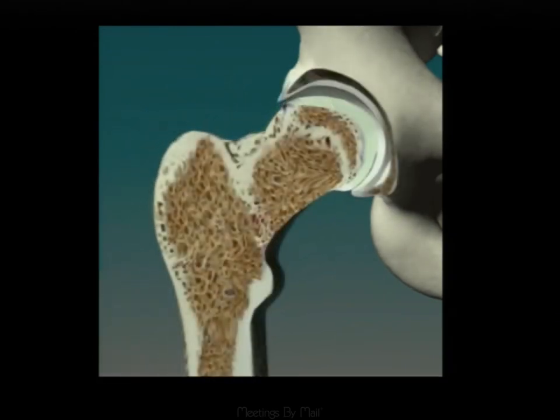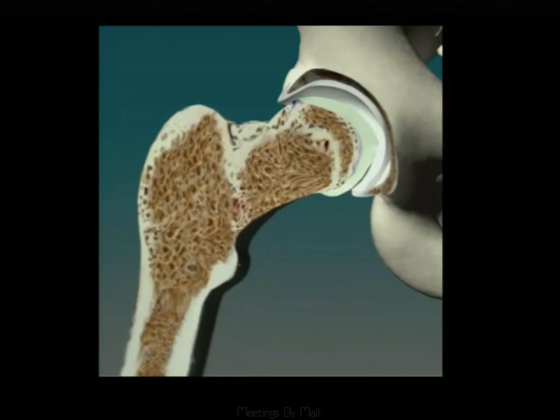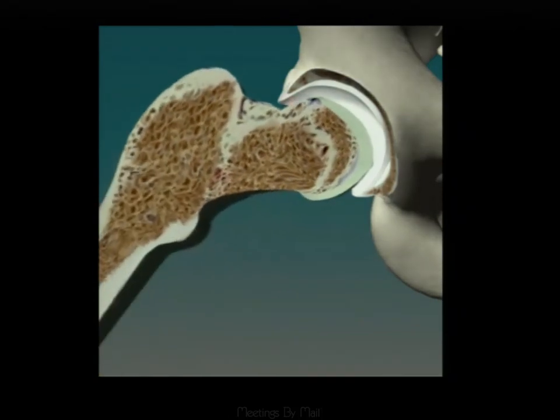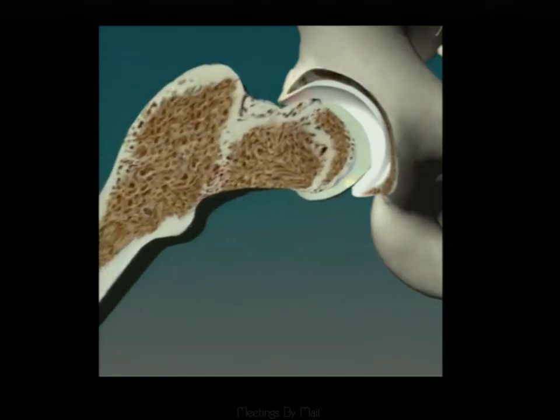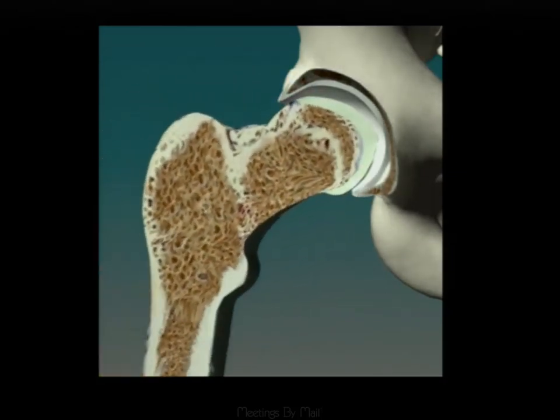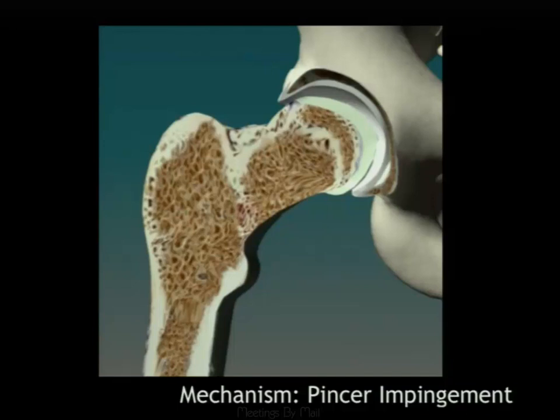This movie shows a pincer deformity. There is normal head-neck offset, but acetabular over-coverage creates a lever arm effect where the normal femoral neck impinges on the labrum. You see cartilage damage superiorly, but also inferiorly during normal motion.